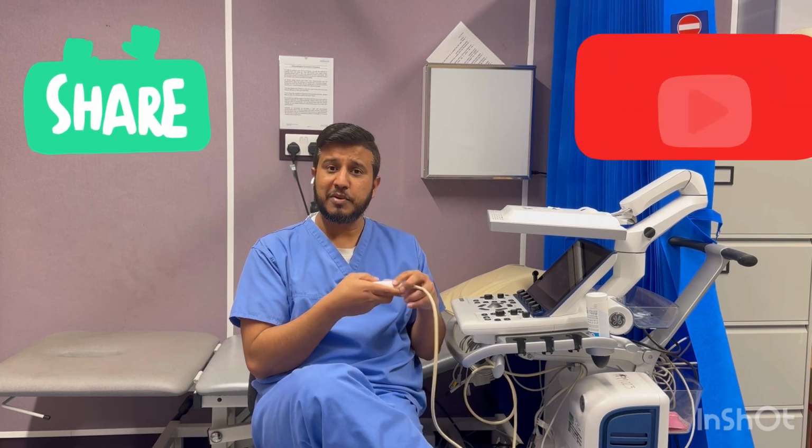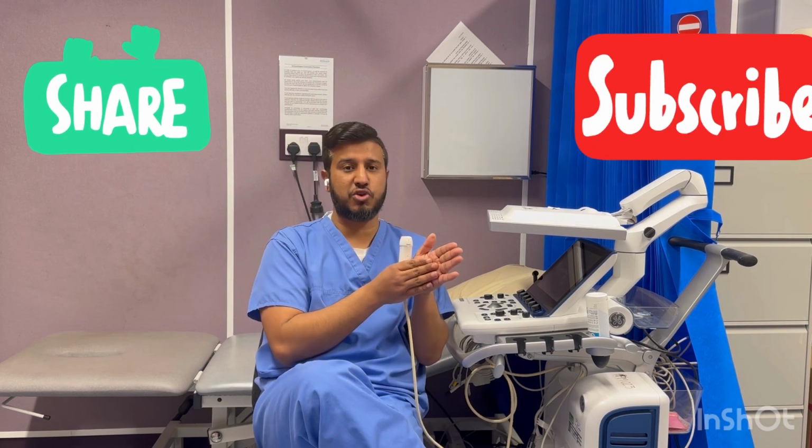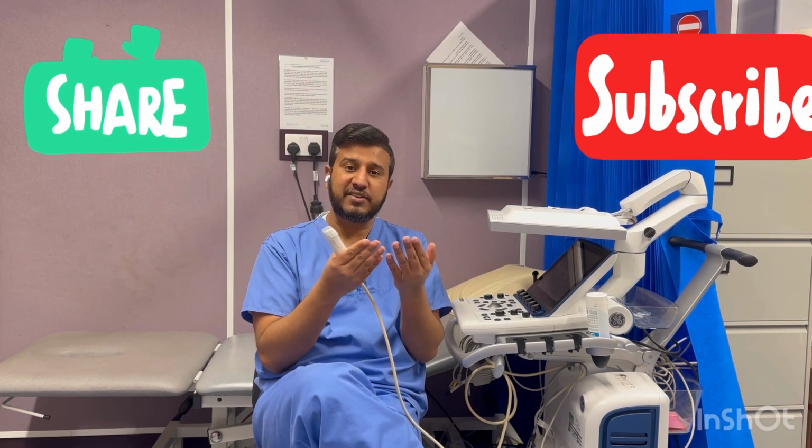So we will start from the parasternal imaging. In parasternal imaging, we get parasternal long axis and parasternal short axis imaging, okay? What is parasternal long axis?